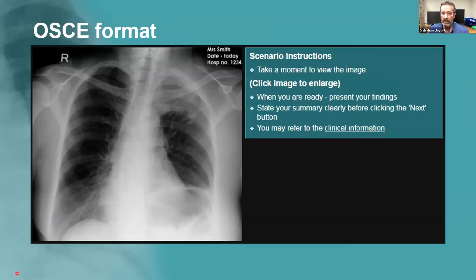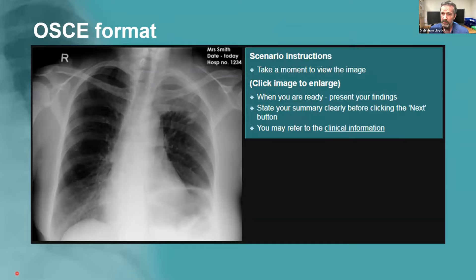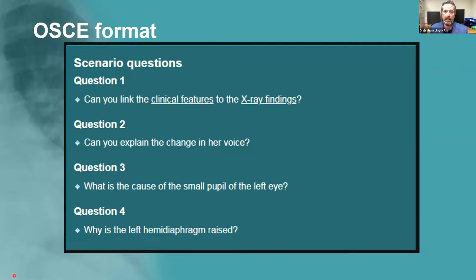You may get an image like this — taken from the first OSCE example on the Radiology Masterclass website — and you'll be asked to present the findings. I'll take you through how to do that. It will be beneficial to anticipate what questions might be asked and even answer them before they've been asked. That said, OSCE examinations are very rigid; examiners are not allowed to go off-piste and ask all sorts of questions, though some are occasionally tempted.